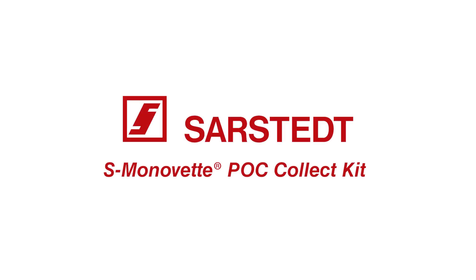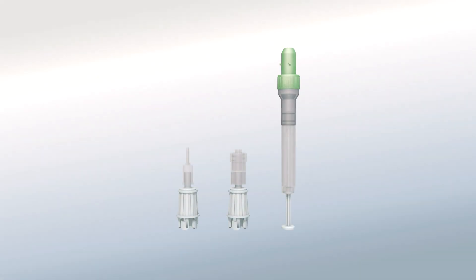Introducing the all-new S. Monovet POC Collect Kit from Sarstedt. This innovative collection kit provides state-of-the-art technology for precise, controlled dispensing into all of your single-use cartridges.